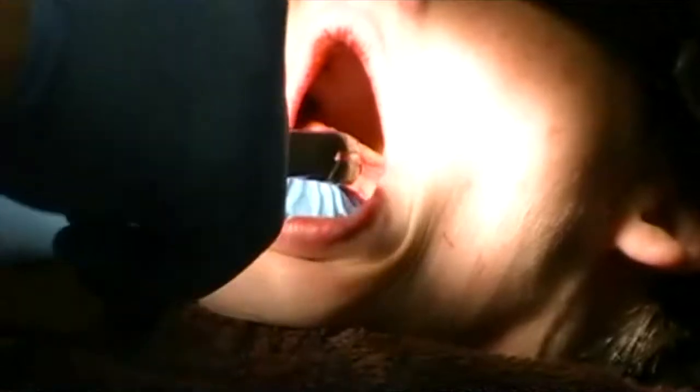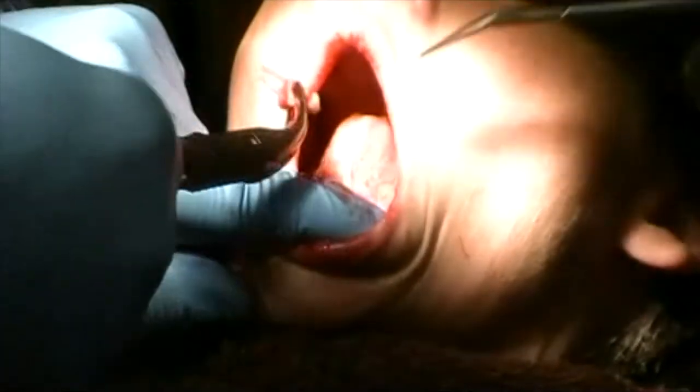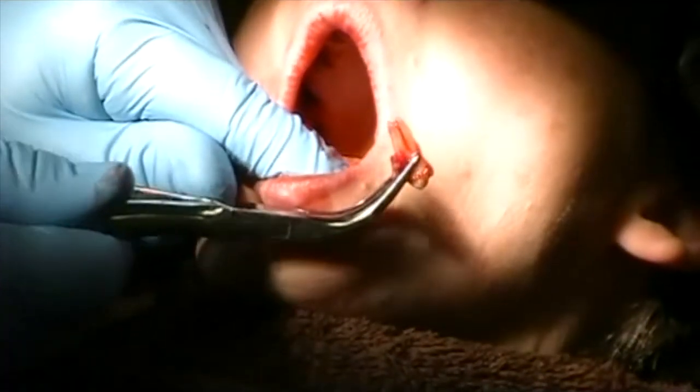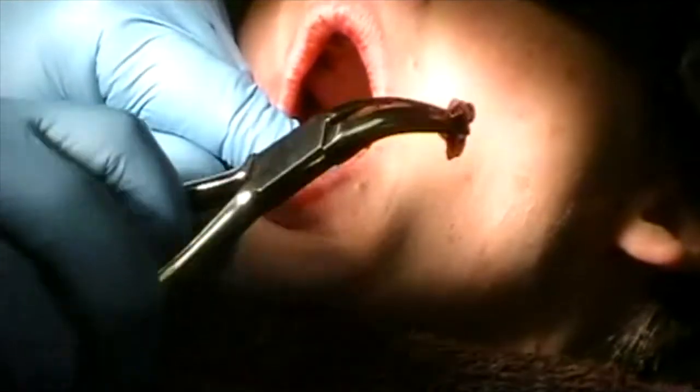I've got some soft tissue that needs to come out. But again, two-rooted, badly decayed tooth on the facial.